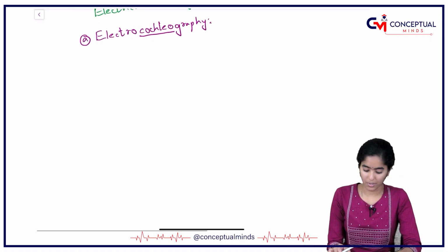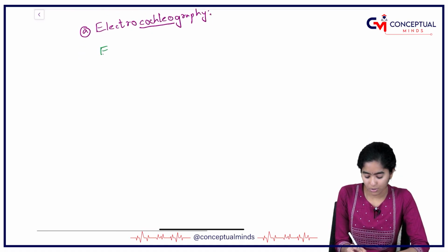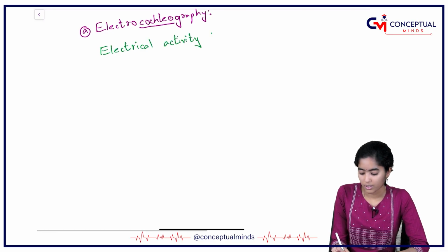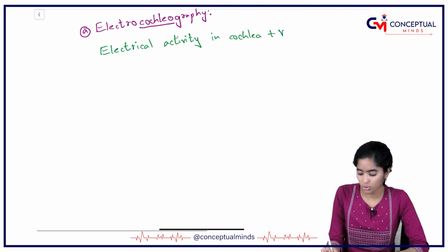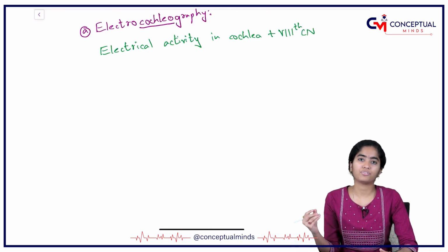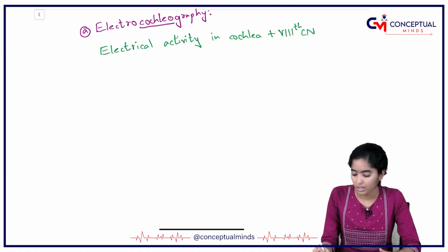So this test measures electrical activity in the cochlea and also the 8th cranial nerve in the first 5 milliseconds after giving a sound.